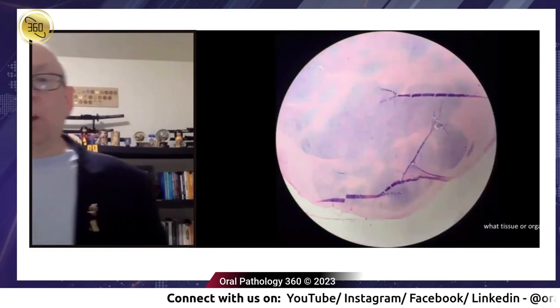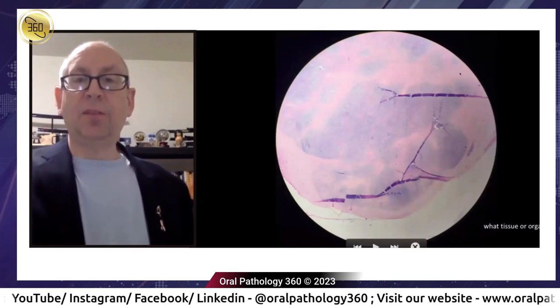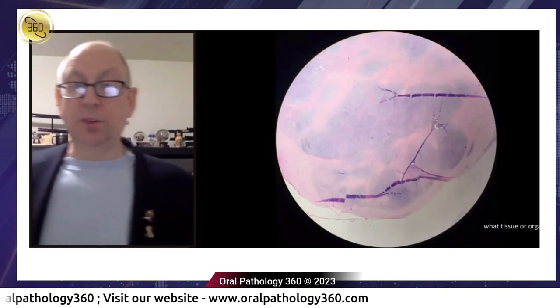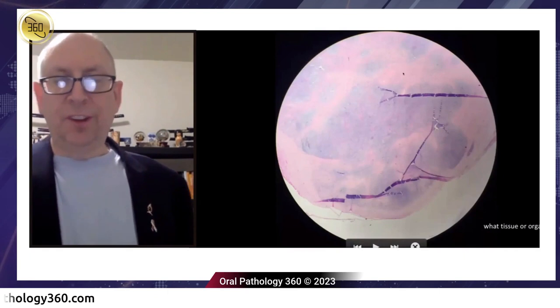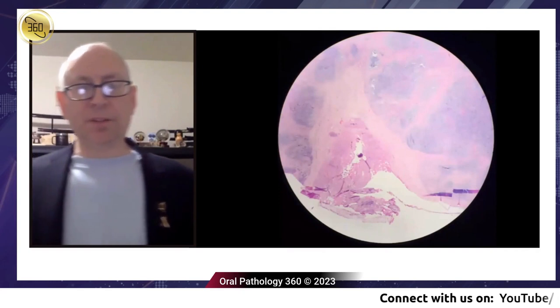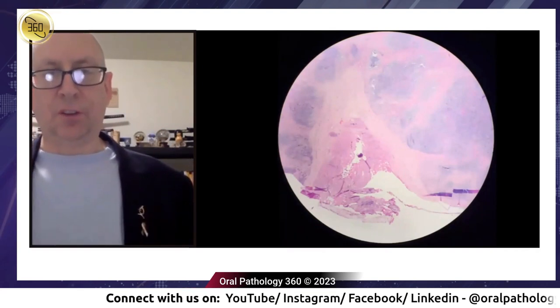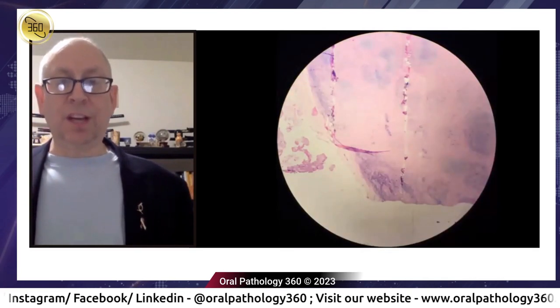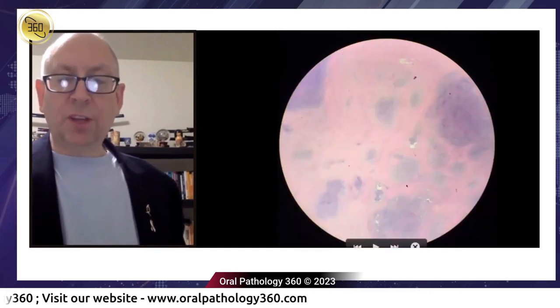Now, you may already know where I'm going with this. I'm going to show you a lymphoid lesion that has a lot of scar-like collagenous septations. I'm going to use the term nodular, and I'm going to use the term sclerosis. So what I'm going to be looking for is a variation of lymphoma. And what's one of the most common lymphomas? Nodular sclerosing Hodgkin's lymphoma. So I've looked at this lymph node. It's occupied by something that's destroying the follicles. But these are still trying to be follicles.